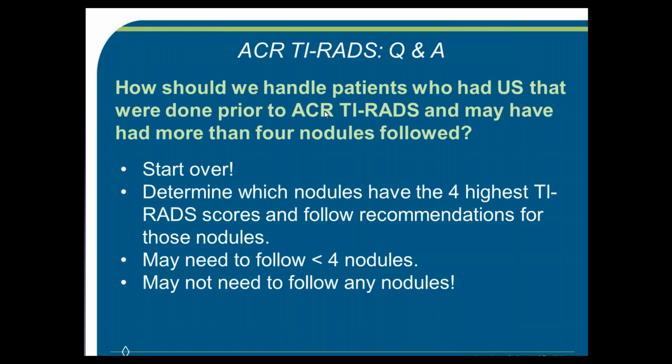In many cases, you'll end up following less than 4 nodules. And if you're lucky, and if the patient and the referring physician are lucky, you won't have to follow any of those nodules that were previously followed prior to TI-RADS.